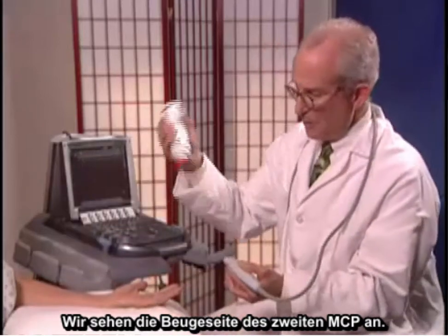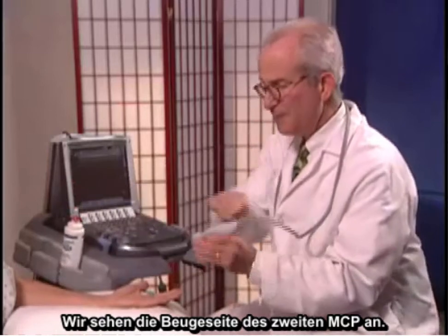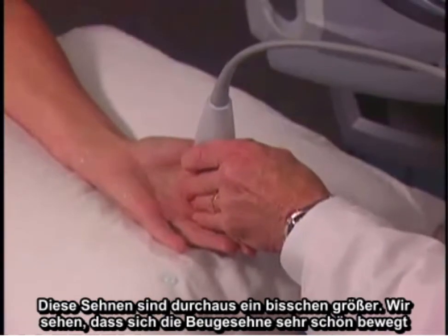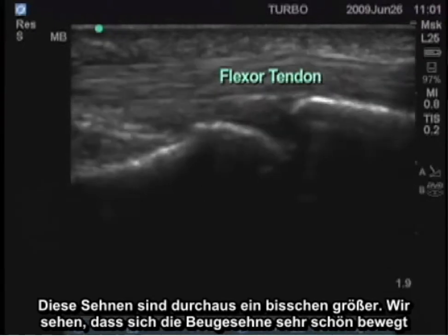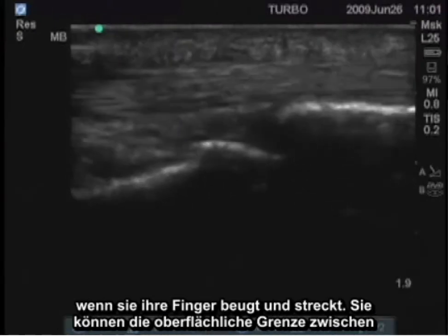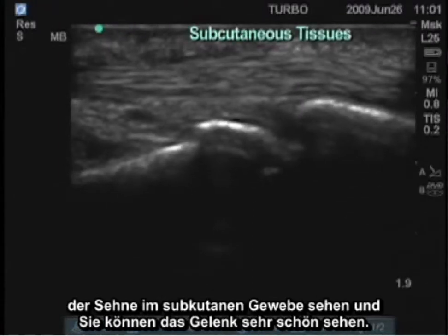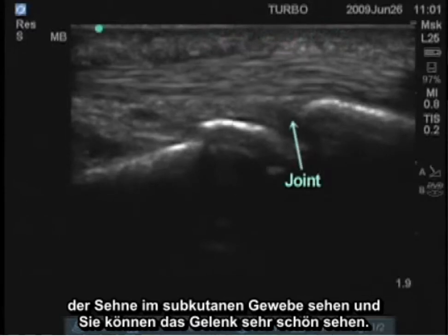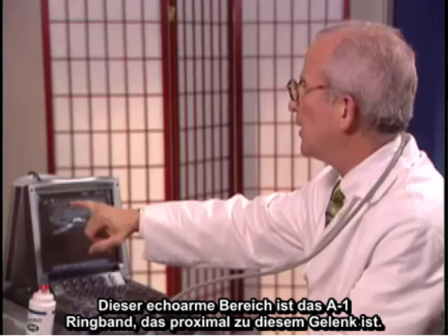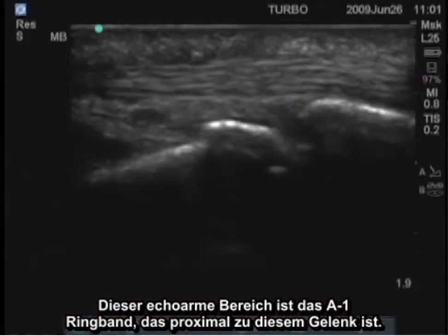We'll look at the flexor surface of the second MCP. These tendons are quite a bit bigger. We see the flexor tendon moving very nicely as she flexes and extends her finger. You can see the superficial border between the tendon and the subcutaneous tissues, and the joint very nicely here. This hypoechoic area is the A1 pulley, which is just proximal to this joint.